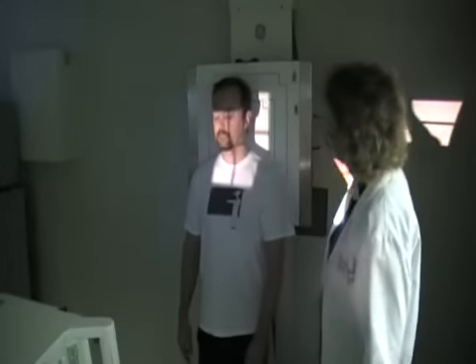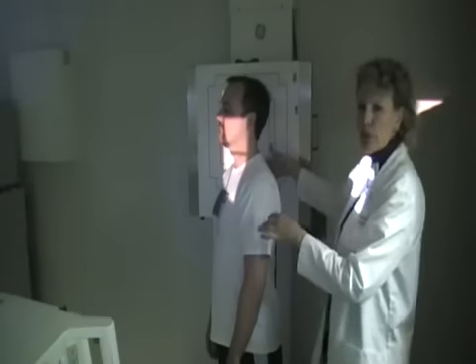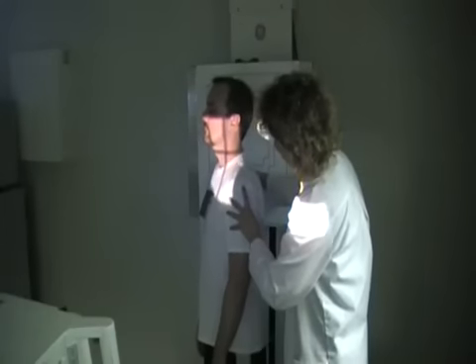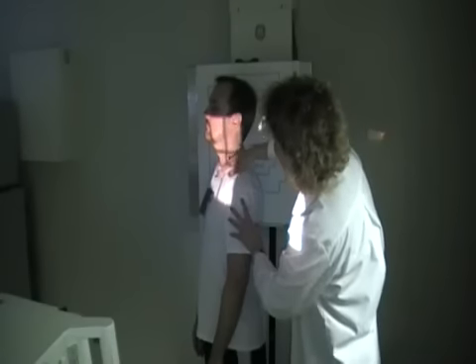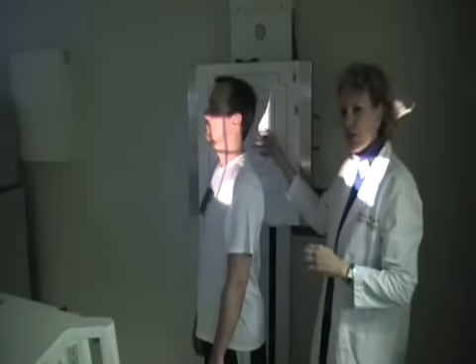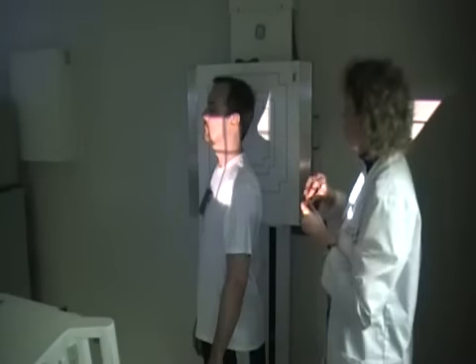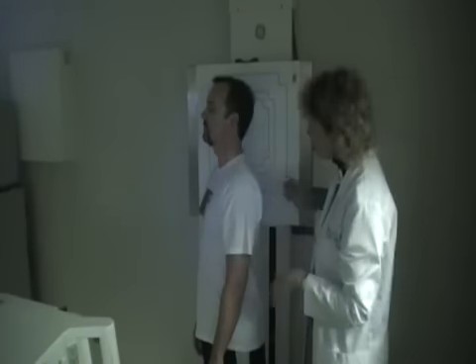Next we're going to do the right AP oblique. The patient's going to turn 45 degrees to the right. Now you want to get your patient centered, okay, so that this line up and down is going right through the mid portion of his neck. Okay, now since his right shoulder is touching up against the board, you do want to use your right marker. And I'm going to place this over by his right shoulder.